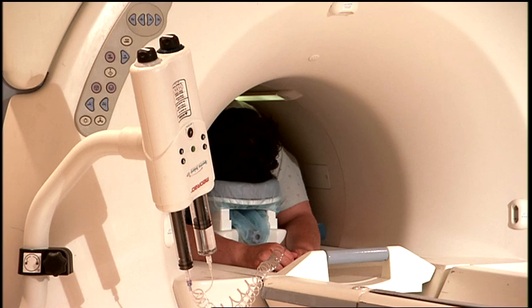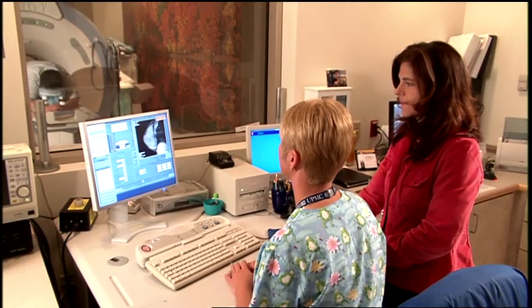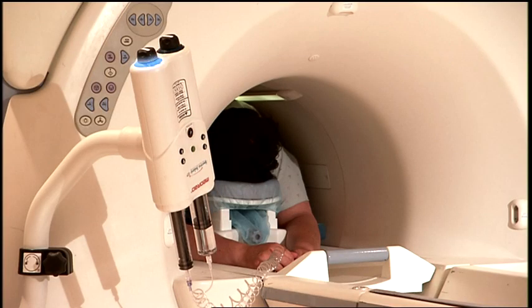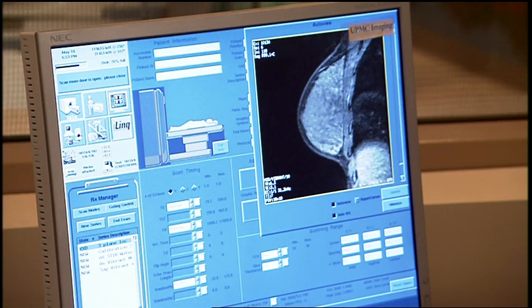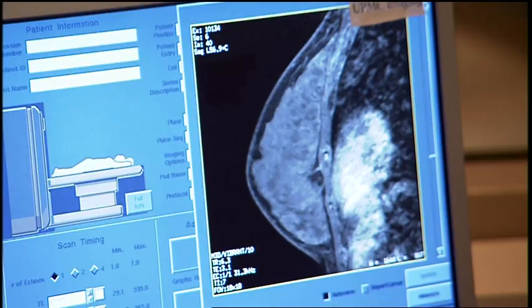A contrast agent is injected to help produce sharper images, which show abnormalities more clearly. It is very important that the patient remain as still as possible throughout this procedure. The radiologist examines the MRI images to identify the area to be biopsied.